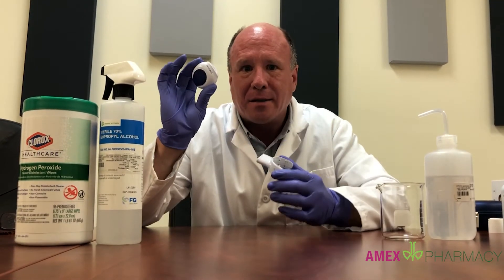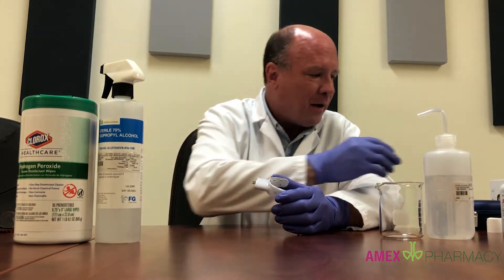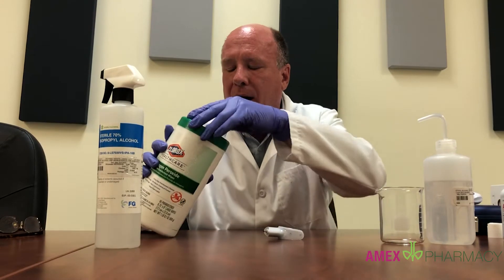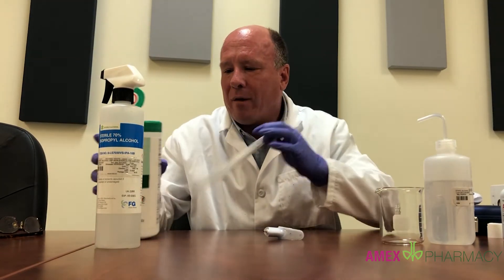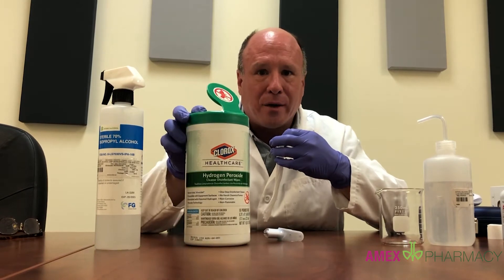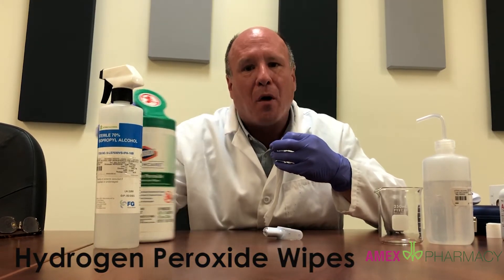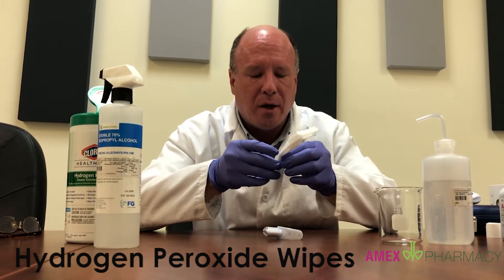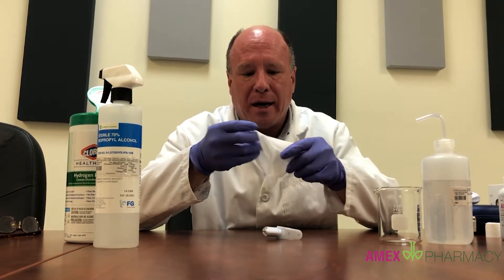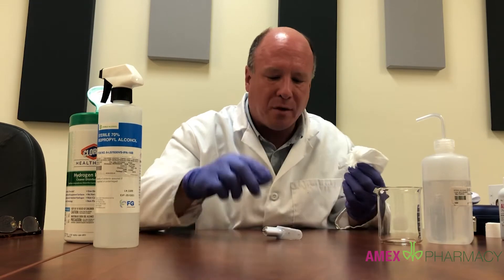You can remove the battery pack, set it aside, or put it on the charger, and simply wipe it down if you've gotten it dirty. We recommend these Clorox wipes — they say Clorox but they're actually hydrogen peroxide wipes, not bleach.